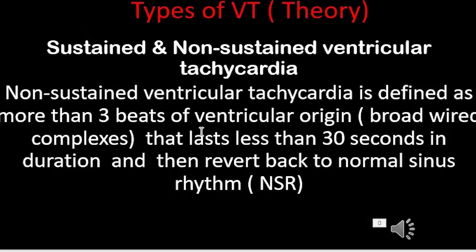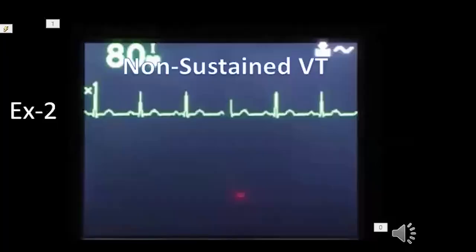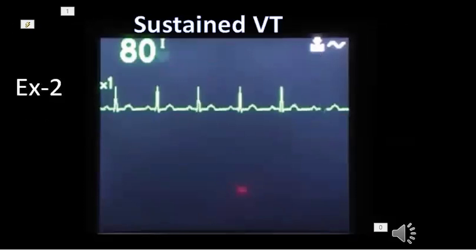From bookish knowledge, you will not be able to make this out. And this is the important role of visual memory, and you should learn the patterns with visualization. So that is important. That's what I want to convey here.